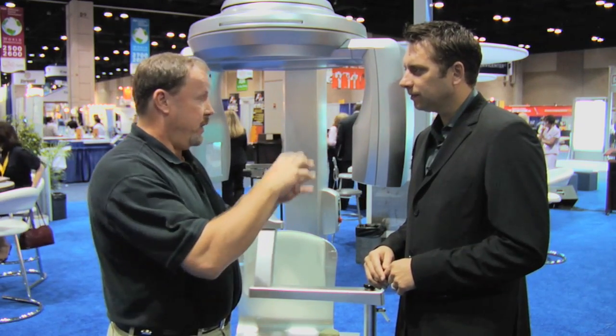So are you using it for root canals and things as well? We do. A lot of our new patients that come in, instead of a full mouth series or a Panorex, will get a scan and maybe 2 or 3 or 4 bite wings. Now you have a 3D model, a virtual head in your computer. From an initial diagnosis standpoint, you can cruise through the scan in any direction and diagnose pathology. When our patients see their own scan in 3D, they get very excited about the treatment plan and what their problems really are. So it's been a great tool for that.